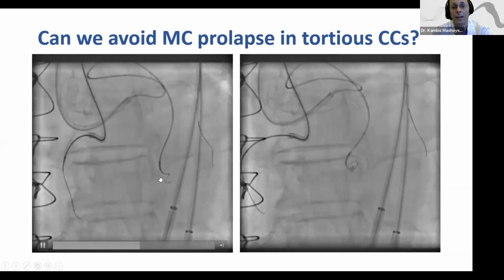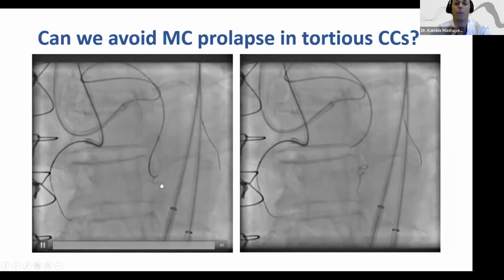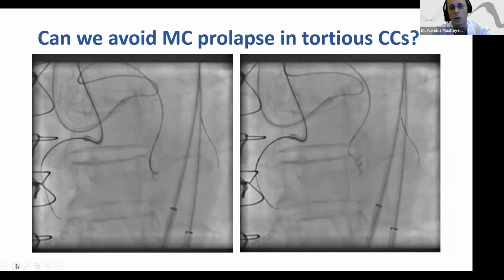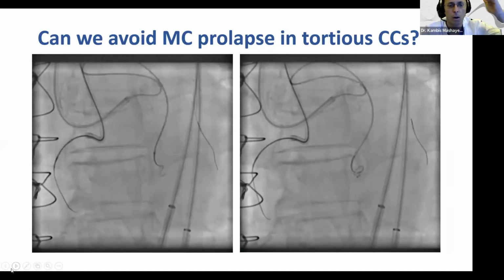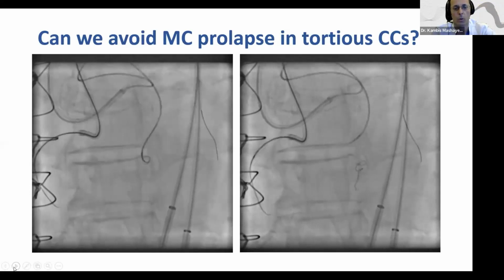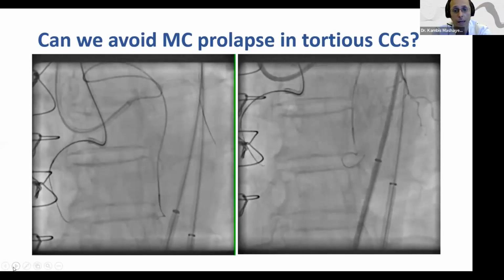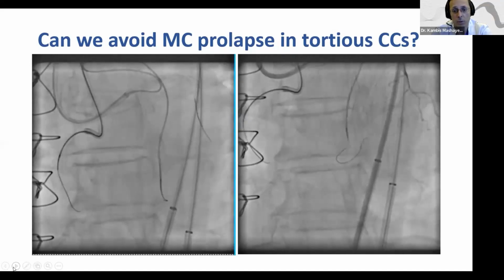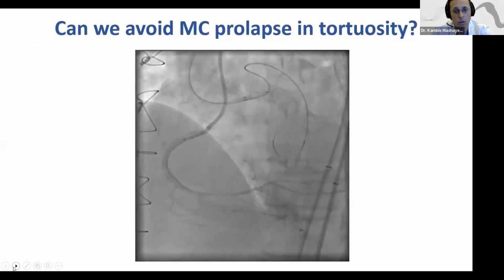When you have no control of your wire here and you would retrieve the wire, the microcatheter tip itself would just crush and destroy the collateral. So here we are on a very, very high risk scale of really having a huge problem when you are destroying this collateral. So you should be very careful, or probably not do that. Yeah, I have to say it. So finally, I was able to pass it, and reverse CART was done. Everything was preserved, and the lady was okay.